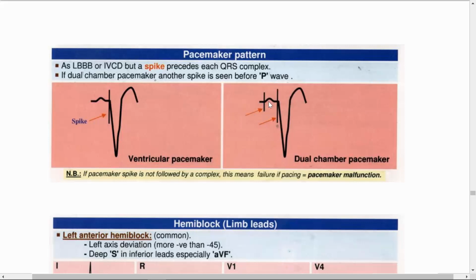If there is atrial activity during the ventricular activity, a P wave activates both atria, and there is atrial contraction, and nothing passes through the AV node to the ventricle.